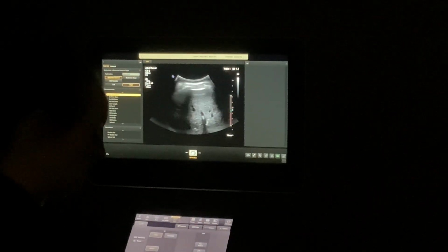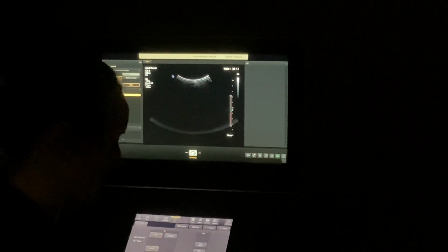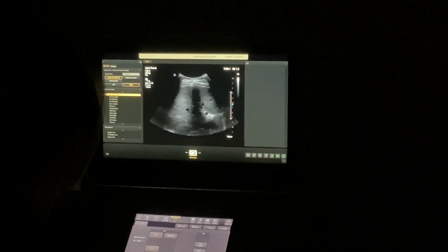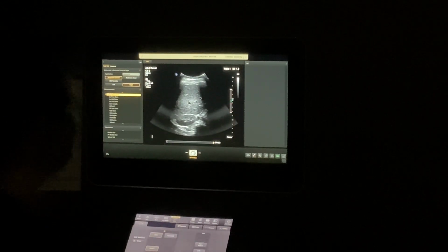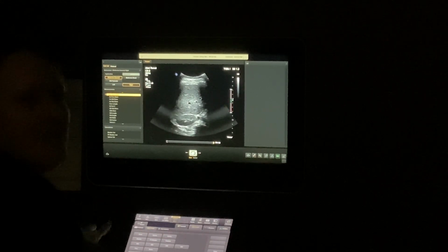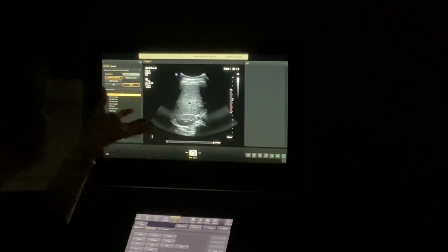Deep breath. So I'm gonna find a different window for her on trans because of where her ribs are. And I'm actually gonna come a little bit more forward and high and come down through her liver. Look at that. And I can see, I still have a little bit of contact loss, so I'll put more gel. But do y'all see how much better that picture looks? Breathe. Yeah. Compared to the one before it. The one before it was kind of like, yeah, that's probably it, but still looks a little unusual. That to me is a better, superior picture.